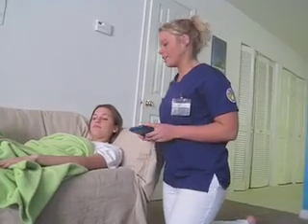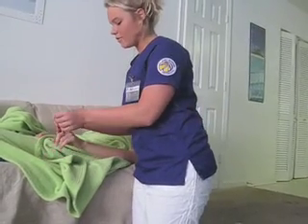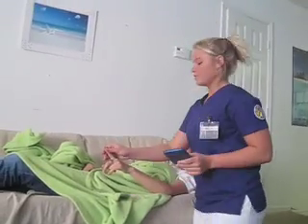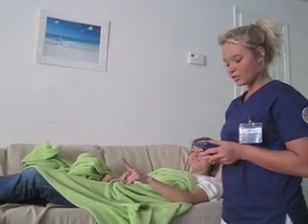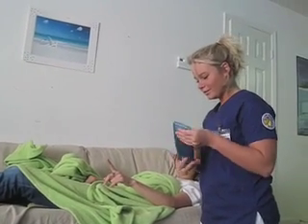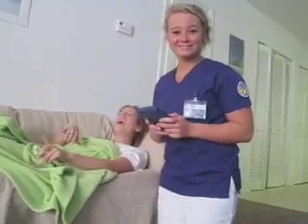Hello, ma'am. I'm here to check your oxygen levels. So to start out, I'm going to put this on your finger. Now the proper placement is it needs to go over the nail bed and wrap around it. Now, because it's the handy-dandy 21st century, this is a wireless system. So normally there would be a cord that connects to your little pulse ox. Turn it on and you wait for the reading. High five! You're at 99%!